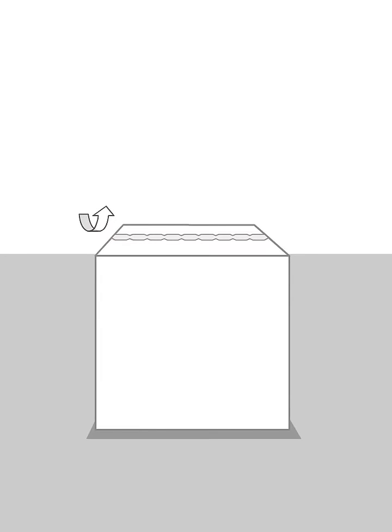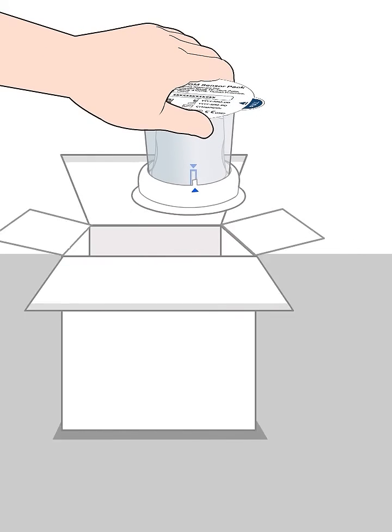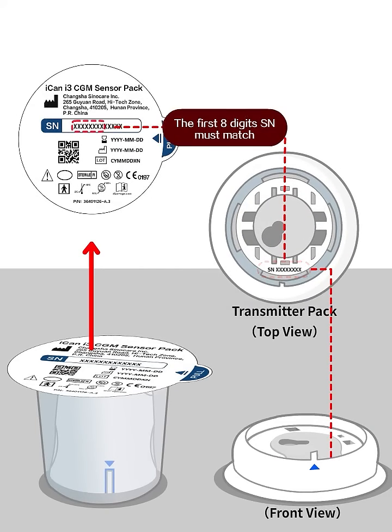Take out the device from the box and pull out the transmitter pack from the bottom of the applicator box. Make sure that the first 8 digits of the SN on the box top are identical to the transmitter pack's SN.